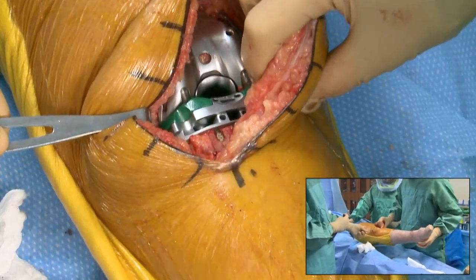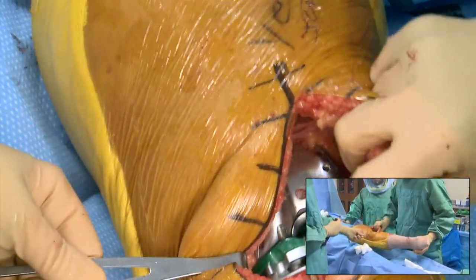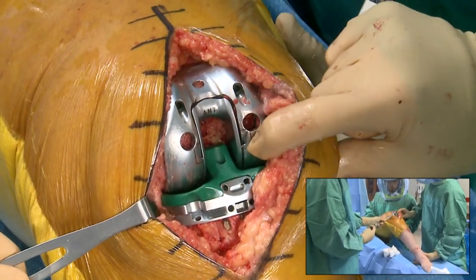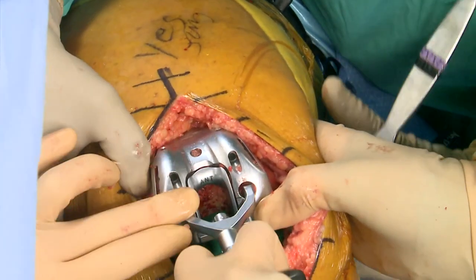Going up to 90 degrees trying not to grunt — we're not lifting off at all. Looks really good. Now we'll take off the trial parts and open up the real components.